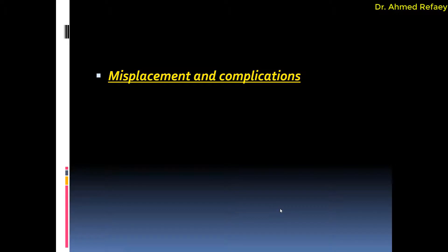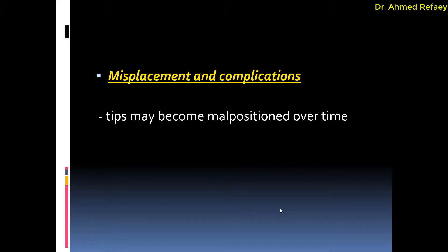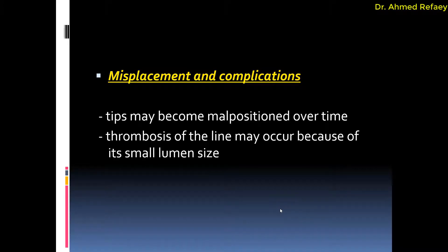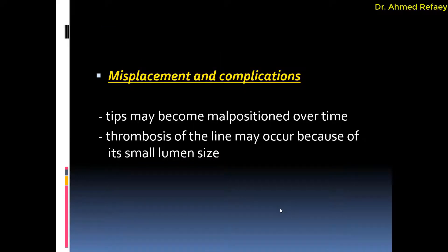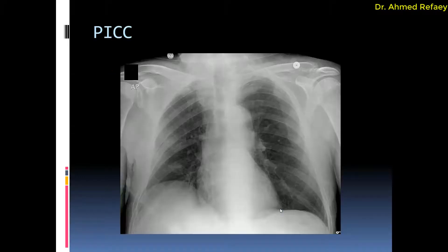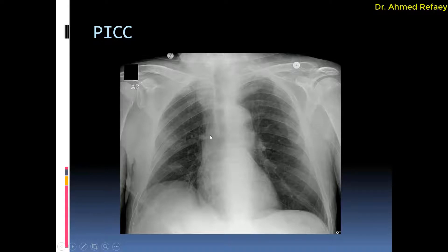Regarding malpositioning and complications: the tip may become malpositioned over time, and thrombosis of the line may occur because of its small lumen size. This example shows correct placement of a peripherally inserted central catheter — inserted through the left antecubital vein, going to the axillary and subclavian vein, left brachiocephalic vein, with its tip located in the region of the superior vena cava.